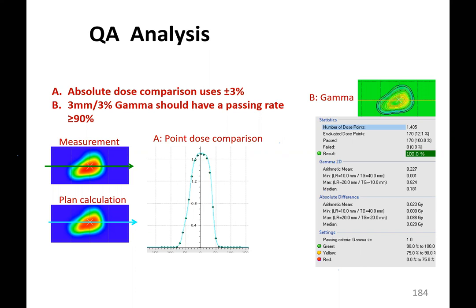So we are not generating the PTVs. We are generating the CTVs. Because I skipped those slides which actually explain why we are doing the CTV instead of the PTV. For the Bragg peak, we don't need a PTV because we are usually covering the distal edges better.